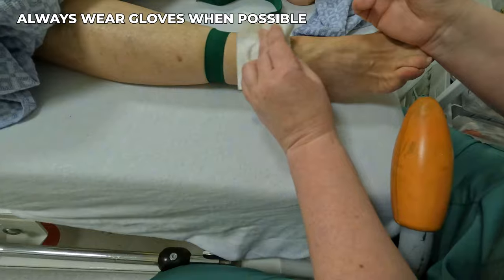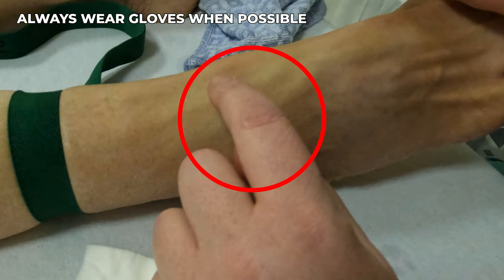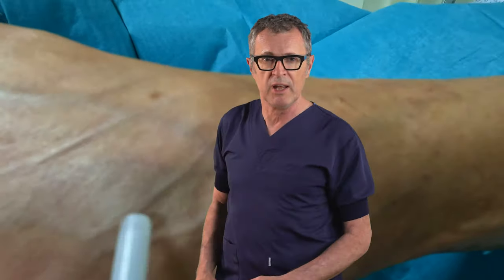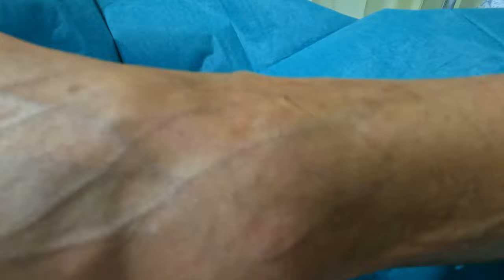When it comes to selecting veins for the insertion of an IV catheter in the foot, vein selection plays a crucial role. Less experienced practitioners might be tempted to insert the IV into larger, more prominent veins, but cannulating large veins with thick walls requires considerably more skill and an expert approach. More seasoned practitioners often opt for smaller, more delicate veins that have tributaries anchoring the main vein, as this approach can provide greater stability and result in a more successful IV insertion.